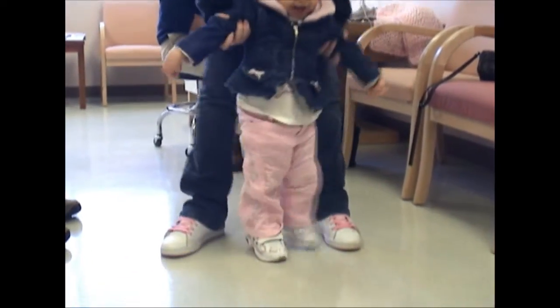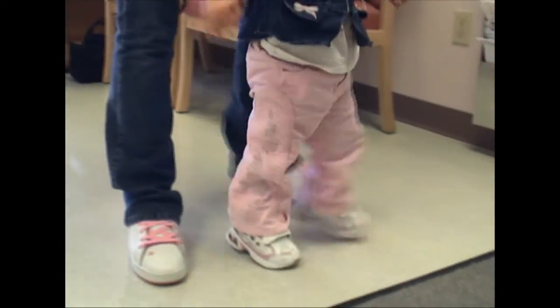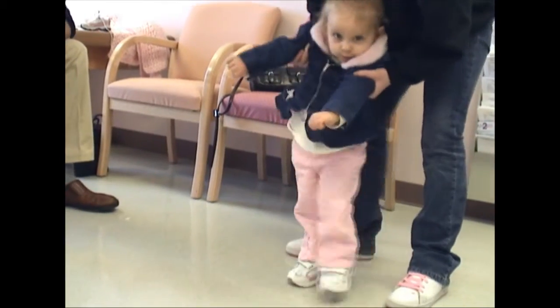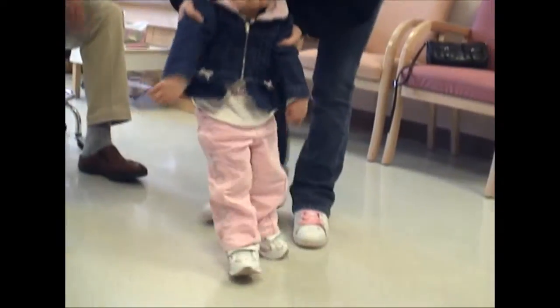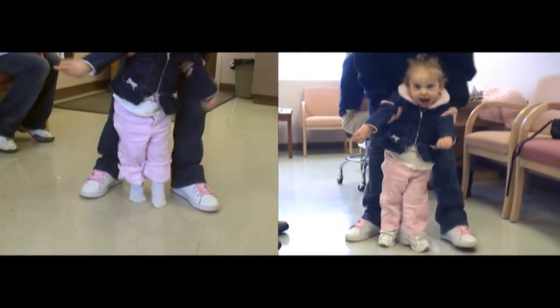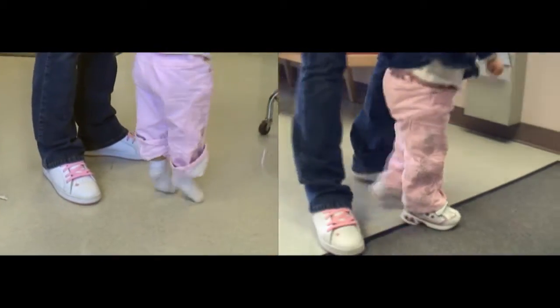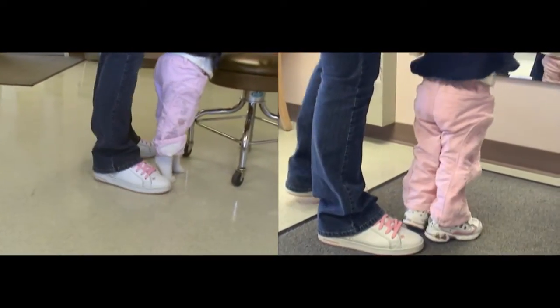Here, Summer is walking with the braces on the Softee 3, and you can tell that her feet are much better controlled. She's walking with a much flatter foot gait. She still needs maximum assist for ambulation and due to the schizencephaly, she walks with a lot of extension tone, even in the upper extremities. In the split view, you can see the improved difference between her ambulating without the orthoses and with the braces. The foot is controlled in a nice position and her feet stay down.